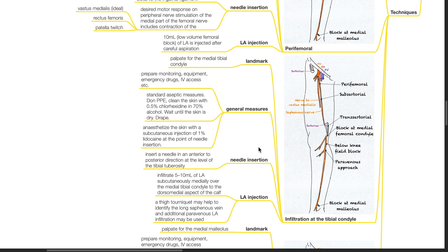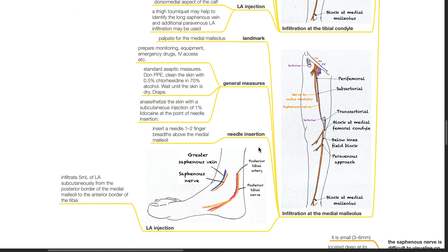Infiltration at the tibial condyle: palpate the medial tibial condyle. Insert a needle in an anterior-to-posterior direction at the level of the tibial tuberosity and infiltrate 5–10 mL of LA subcutaneously medially over the medial tibial condyle to the dorsomedial aspect of the calf. A tourniquet may help to identify the long saphenous vein, and additional paravenous LA infiltration may be used. Infiltration at the medial malleolus: insert a needle 1–2 finger breadths above the medial malleolus and infiltrate 5 mL of LA subcutaneously from the posterior border of the medial malleolus to the anterior border of the tibia.